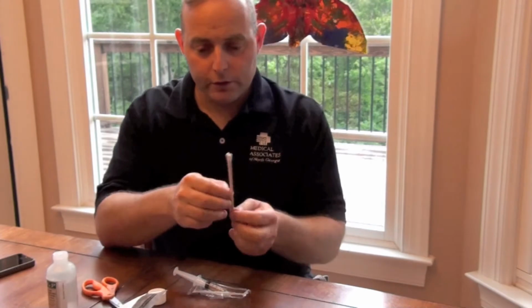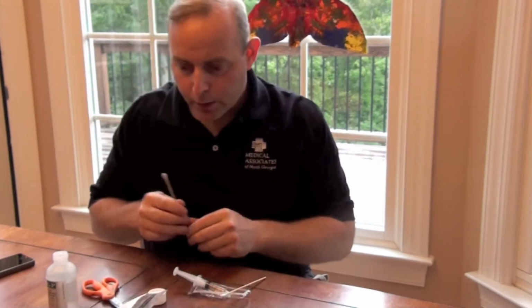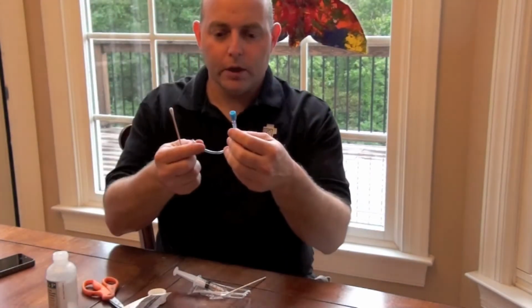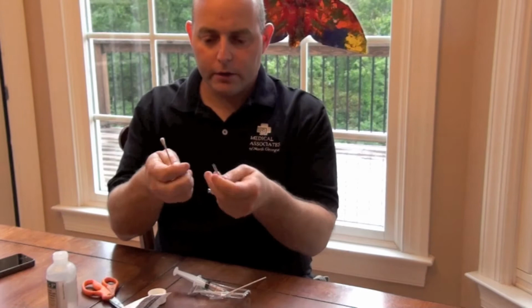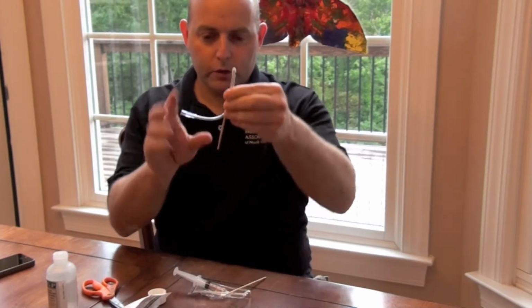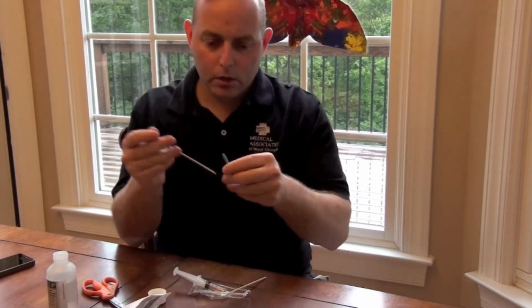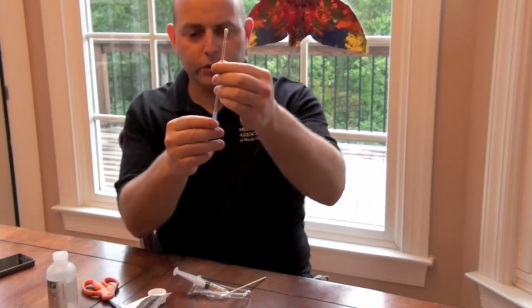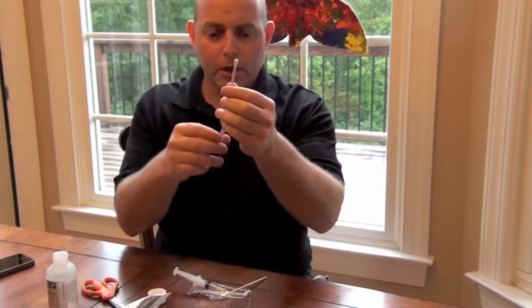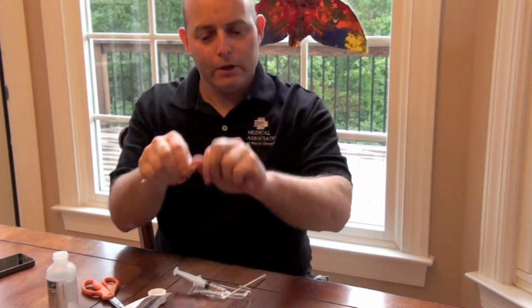These are 5cc syringes, and these are sterile cotton-tipped applicators. We'll take our luer lock, and there's our male connector, and we will insert this pretty much all the way in as a whole unit. Or if need be, if it won't go all the way in, like in this one, just a little bit far from the end, you can jam it in so it's in the luer lock, or it's fine to just break off about 1 inch.